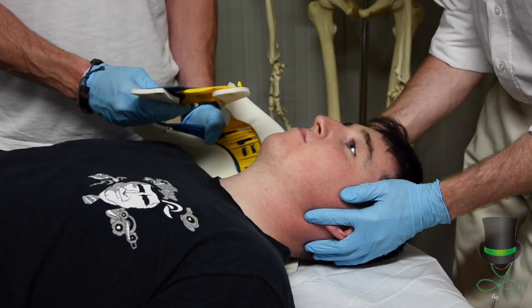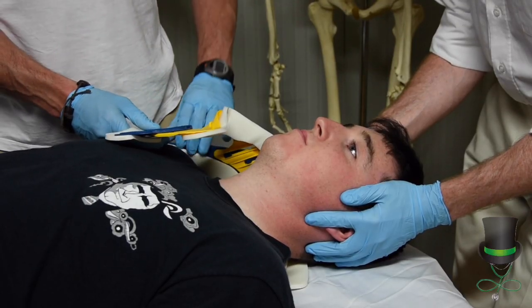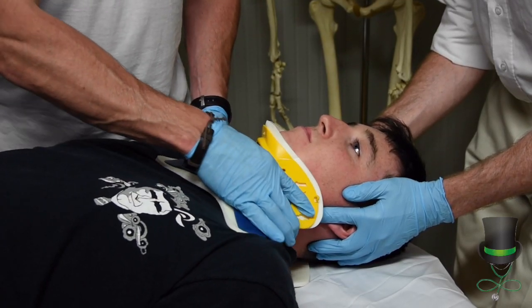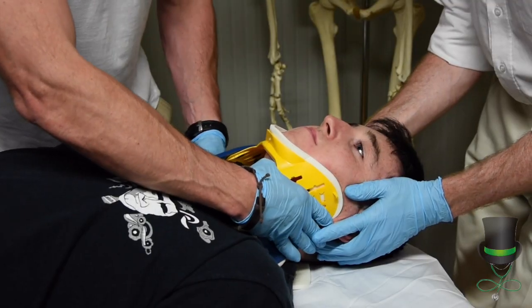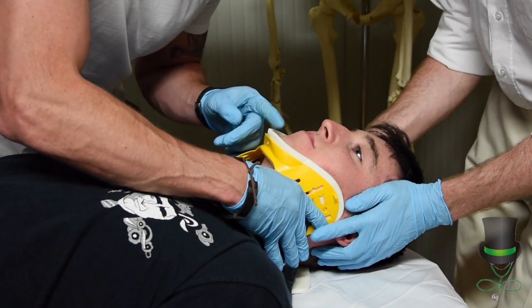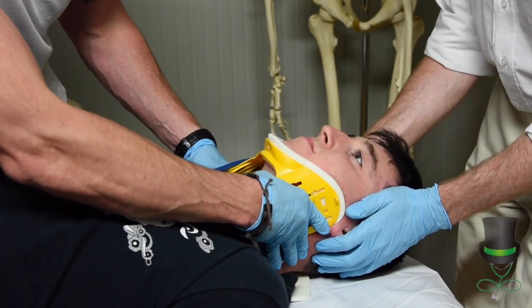Place the back of the collar in behind the back of the patient's neck, and you can explain to the patient that this will not be too comfortable — it's not designed to be comfortable. Ensure that the pin is sitting under the chin of the patient and that the collar is centrally aligned down the middle of the chest.